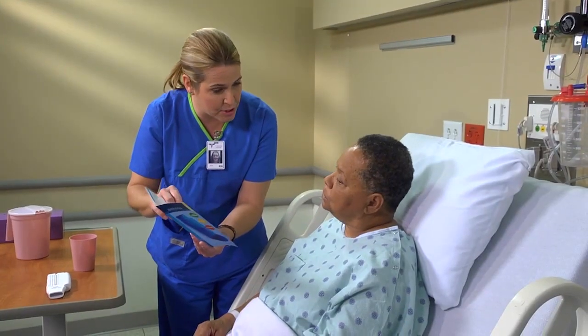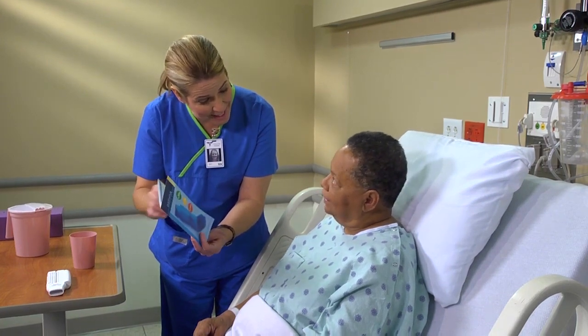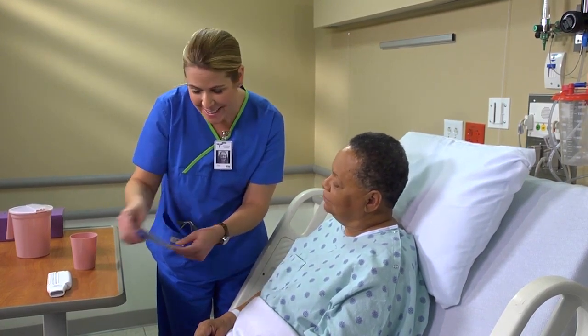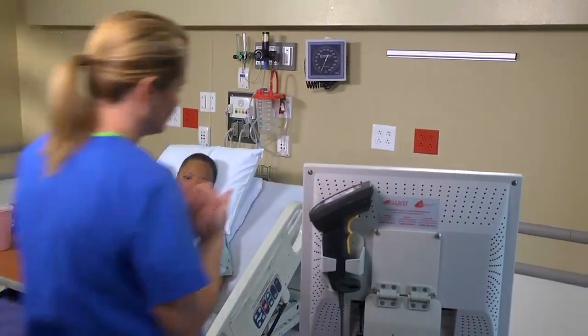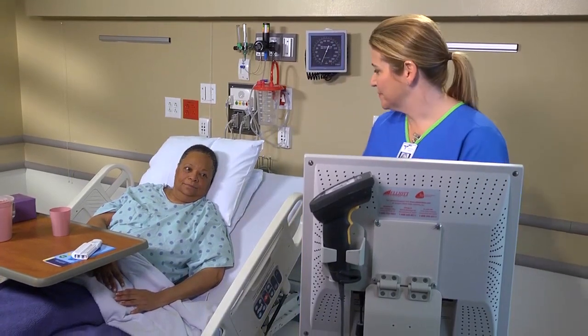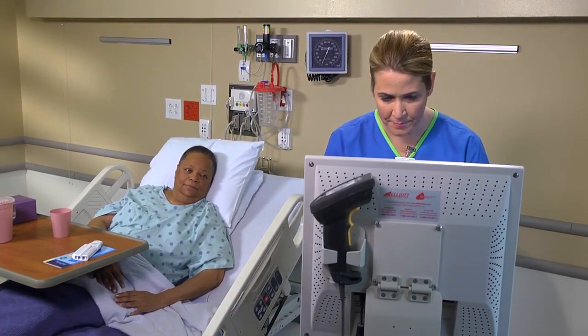Help your patient implement the action plan suggested by her healthcare provider. Finish your care by instructing her to clean the flow meter unit weekly, following the manufacturer's instructions. Perform hand hygiene and document your assessment and all actions related to oxygenation and patient education.